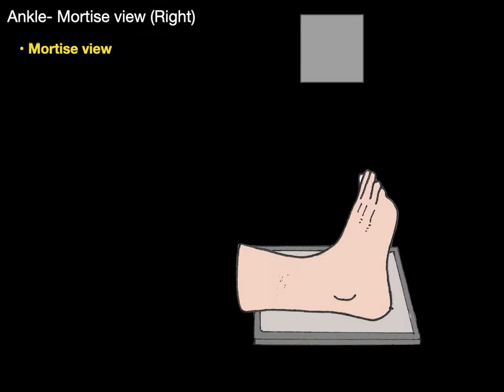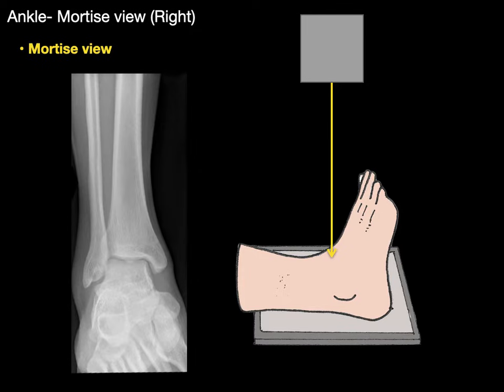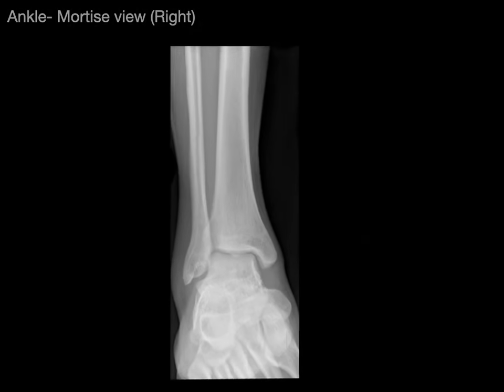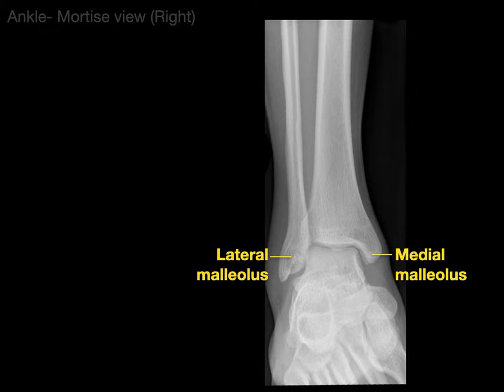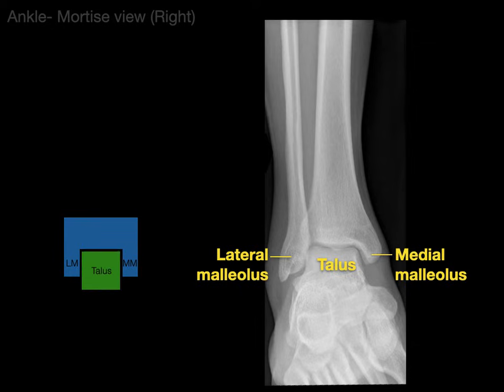Now let's do a mortise view. What that means is when the foot is just medially rotated where the great toe points a little bit more in when the x-ray is taken. It gives a view which is similar but provides a much greater view of the mortise joint, which is a combination of our lateral malleolus, medial malleolus, and the talus. Here you can see the mortise joint where the LM and MM are the lateral and medial malleoli.